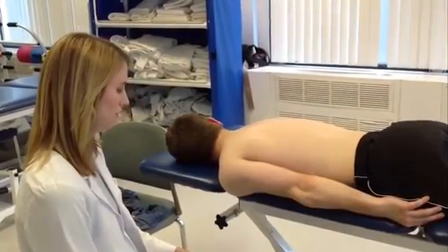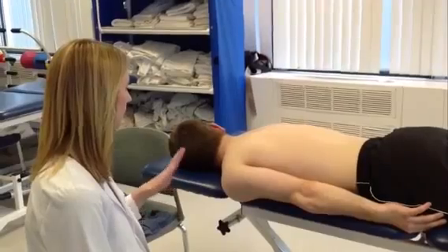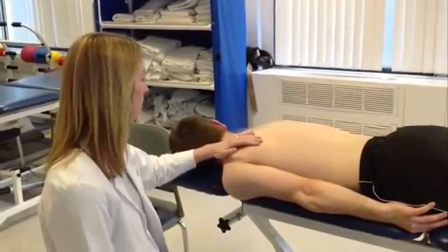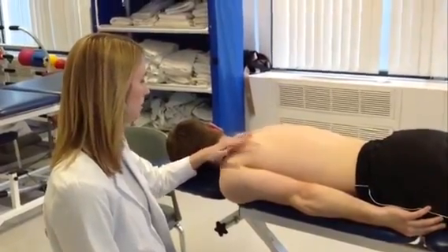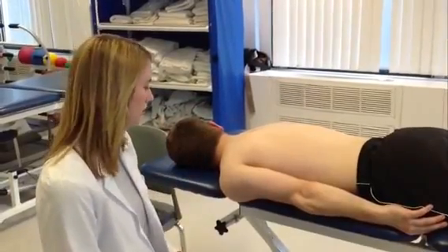So in this movement, I want to take out the motion of your shoulder blade and your clavicle, collarbone. So this time I'm going to be palpating right at the inferior angle of the scapula. So right when that starts to move up, that would mean that there's some shoulder complex extension going on too. So I want to stop the motion there.